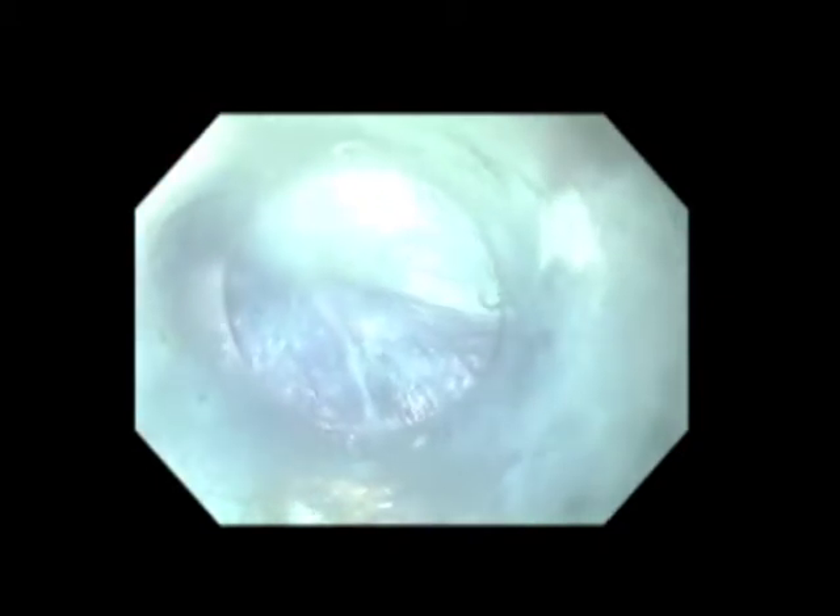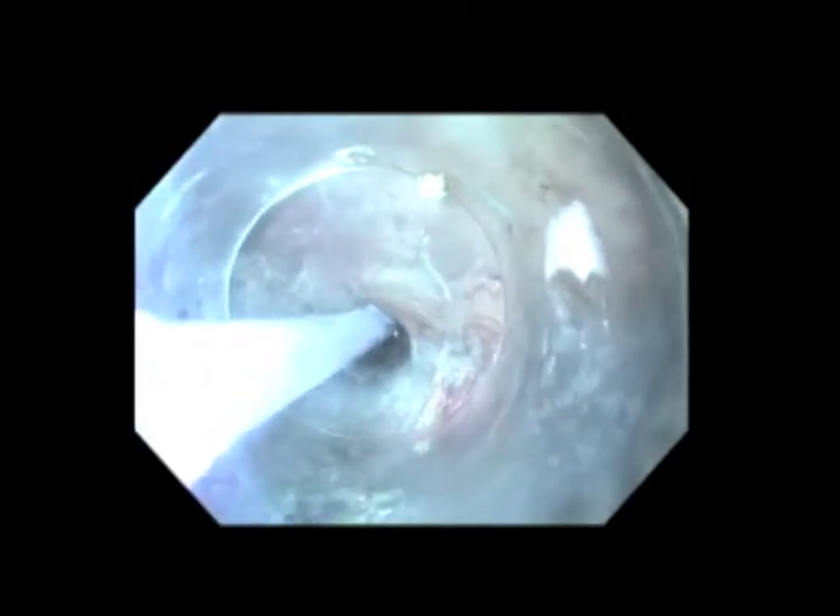The scope is incrementally advanced bluntly, which puts the submucosal areolar tissue on stretch. At that point, it can be safely divided with electrocautery, and blood vessels as we see here can be identified more easily. We periodically inject more indigo carmine and saline solution to aid in hydrodissection, as well as mark progression of the tunnel.